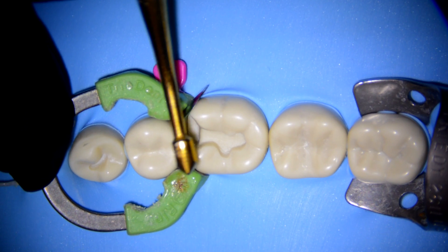What about the sectional matrix system? A lot of brands have come out with this system to restore teeth and it really is incredible because it solves a lot of the adaptation and contact problems that the Toffelmire gave us. Let me show you what I mean.